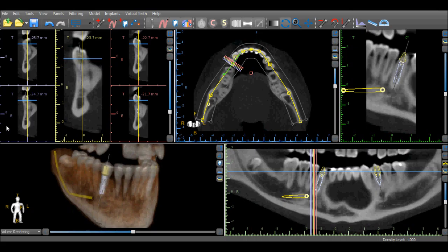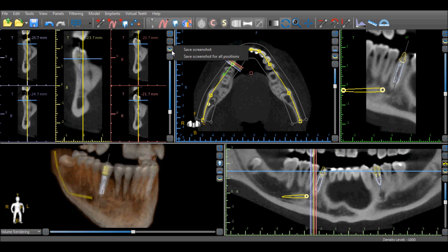The Blue Sky Plan treatment planning software allows the user to save images and create reports directly from the software. On the right side of every view there is a camera icon. If the camera icon is selected, the user has the option to save the screenshot currently on the screen for that view, or to save the screenshot for all positions.